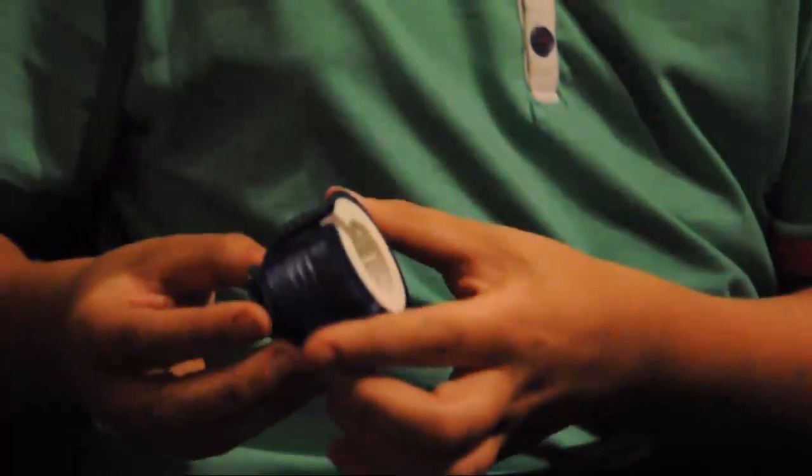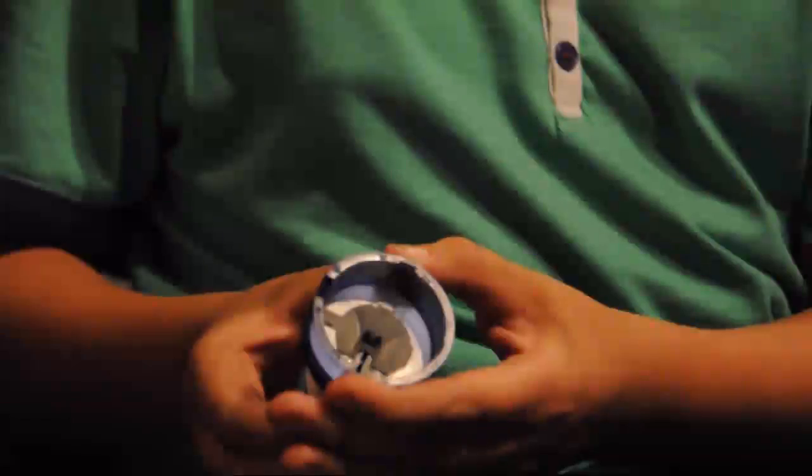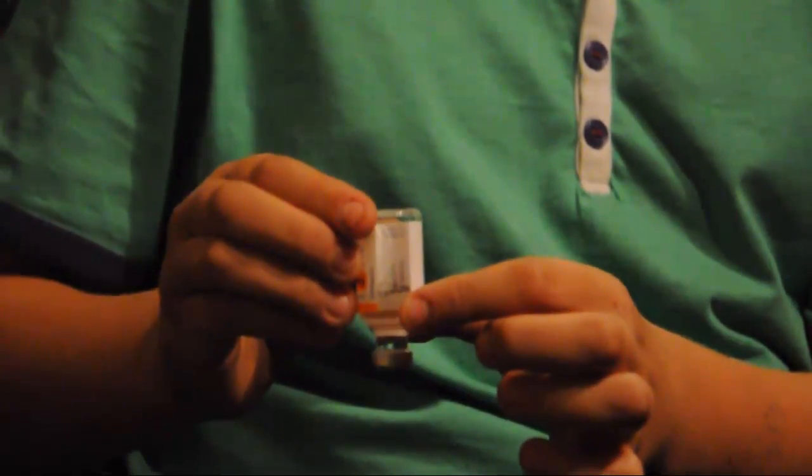This is the quick inserter. The quick set goes in there, you pull it back, press those two buttons and it will go in. And this is the insulin vial which holds the insulin, and then you just connect that to the reservoir like that. The first thing I have to do is to disconnect the pump from my body.